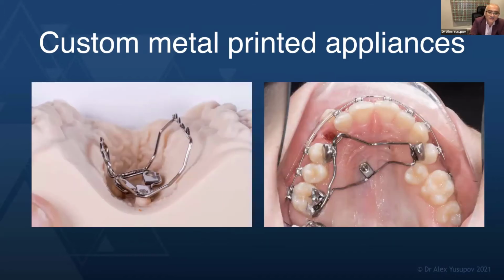We can design systems to intrude teeth on one side and correct scissor bites on the other. We can augment our anchorage with a single TAD and just move that 3 without skewing the arch form and open up the space on the left 5 at the same time. This ability to look at the model in the lab and just draw a picture and your lab technician works it out is just incredible. And the framework on the right side is all 3D printed.